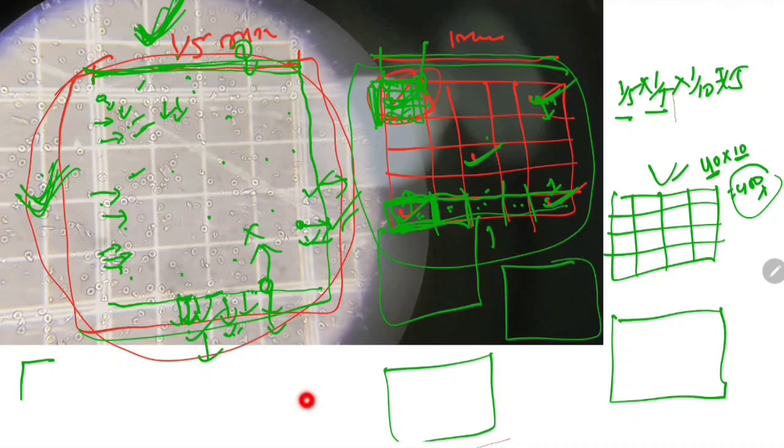Ideally it should go in the next box, and right is the next box, because right is actually left of the next box, and lower is actually upper of the next box. Clear? So left and upper we have to consider, and right and lower we should discard. Why discard? Because I think now you are clear about all the things. So again I am repeating, the middle line is the reference line, left and upper we should consider inside the box, and with the same formula right and lower we will consider in the next box.